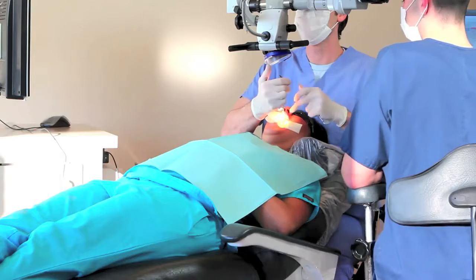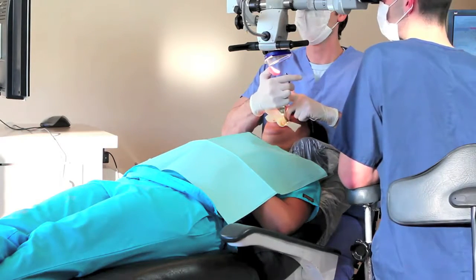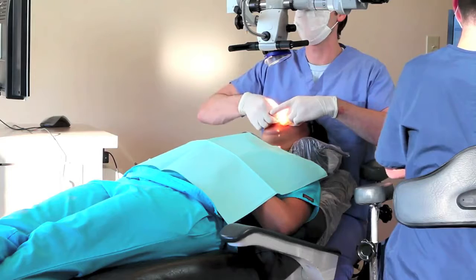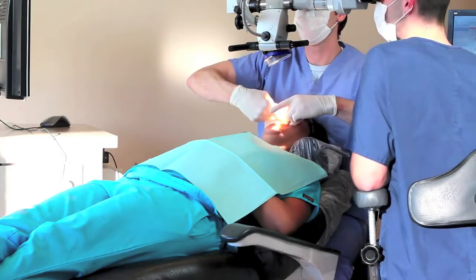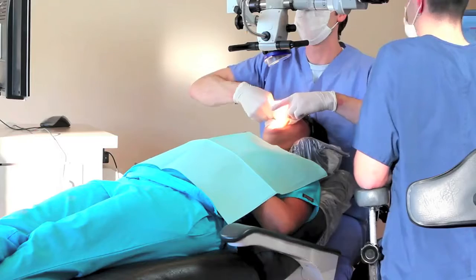But what I want to show you here is, as I'm manipulating that rubber dam, as soon as the rubber dam forceps leaves that retainer, my finger's on that. I don't want it to pop off. Then I'm going to manipulate that rubber dam around my retainer and around my frame. You're going to see my finger, in some capacity, stay on the back of that retainer. Why? Because as I stretch that latex or non-latex rubber dam over that retainer, if it's not on there tight enough, it's going to fling off.